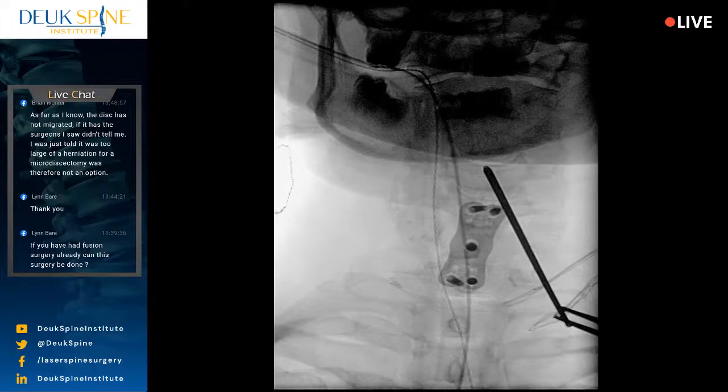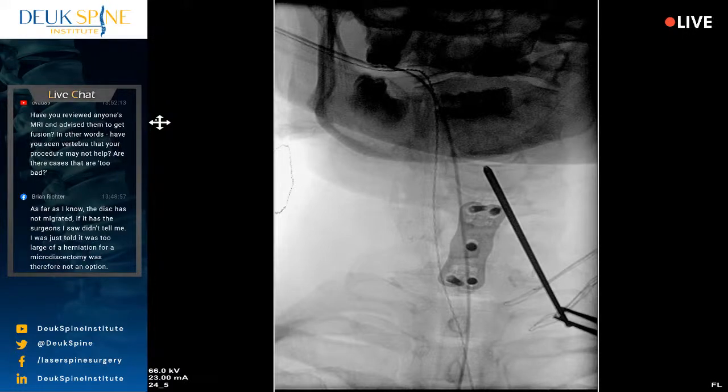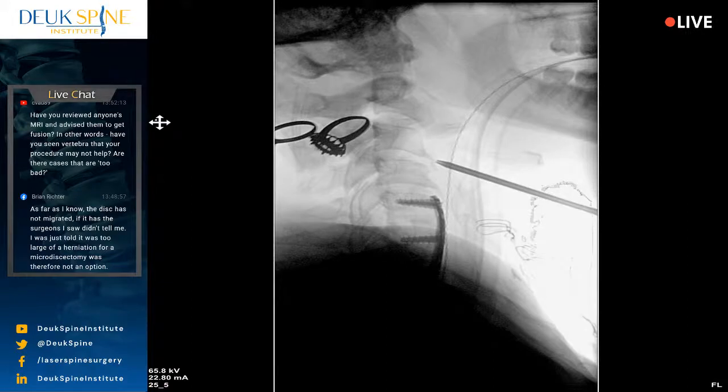Shot. Perfect. Lateral. Take. Are you ready, doctor? Mallet. Thank you. Whenever you need to do something delicate in the spine, you grab a mallet. Shot.